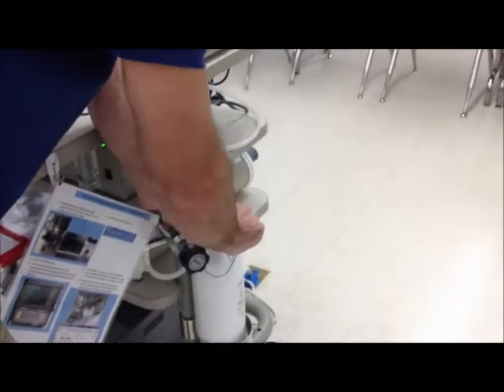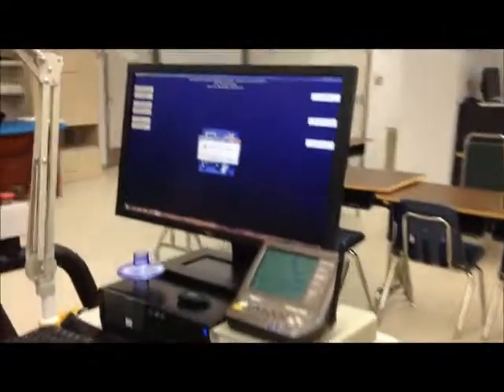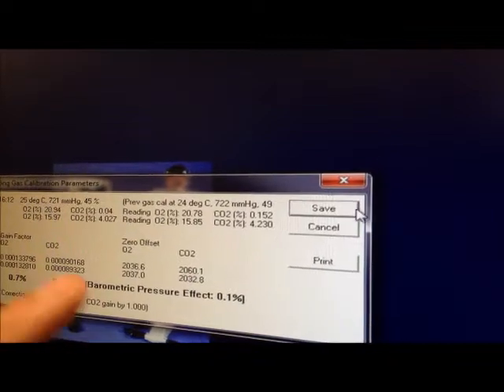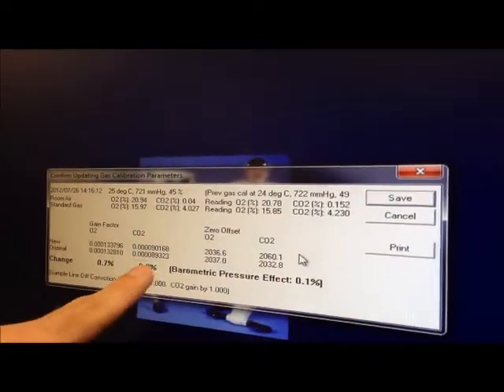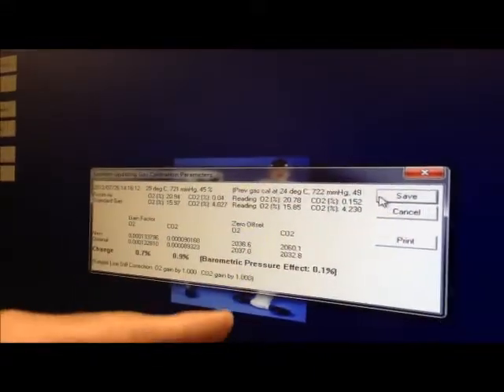Do as it says, turn the gas off. Only turn it to that off point — don't over-tighten the valve. After gas calibration is complete, go ahead and click save. If it doesn't pass, if you don't see 3% — if you see over 3% on either one of these values — you want to go ahead and cancel and then redo gas calibration.